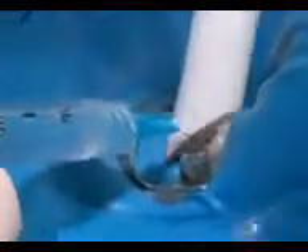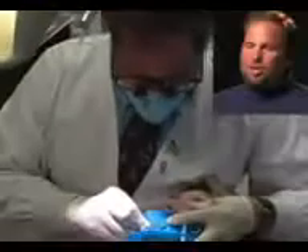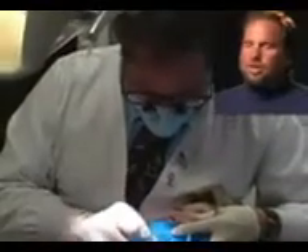Here I'm irrigating the canal and keeping it clean with sodium hypochlorite, which disinfects as I'm shaping the canal. Now I'm going back in with my rotary file to clean and shape the root canal. Engine-driven files increase the accuracy of the preparation inside the tooth and also make root canals a lot faster than they used to be.